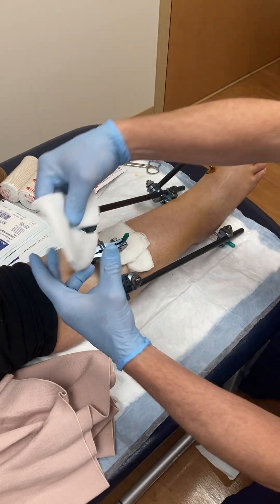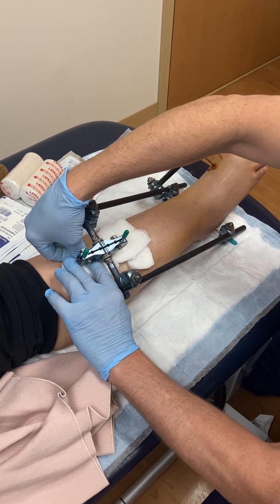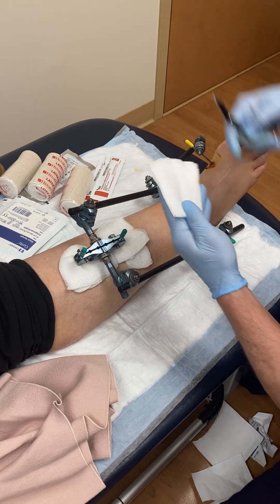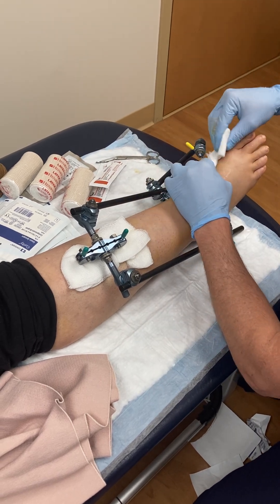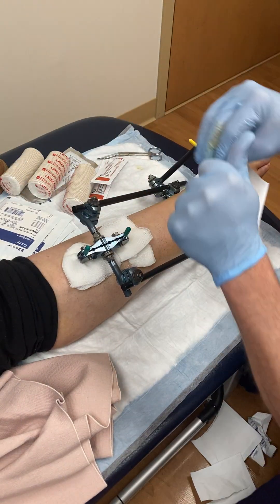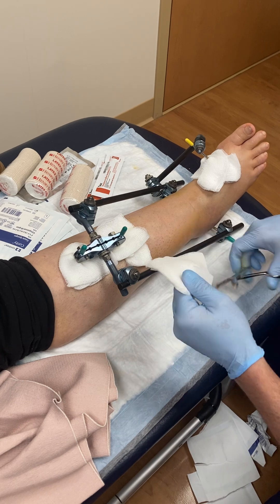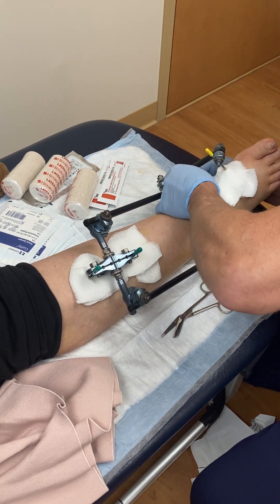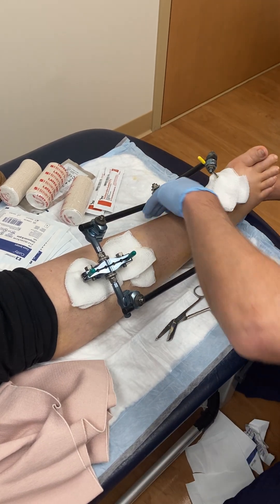As long as you're using a clean technique, you don't have to have sterile gloves — you can just use a regular exam glove. What I typically do is send all of these patients home having received this instruction, and I also like to send them home with a patient-belongings goodie bag that has all of the supplies they need to do this until they come back and see me in the office. That way we can safely take care of these problems without developing any pin site infections that might compromise their health.